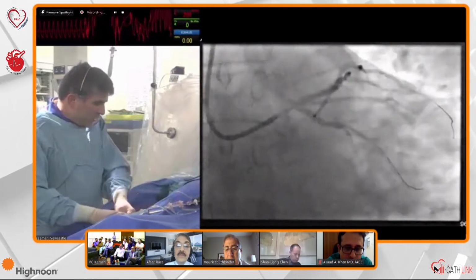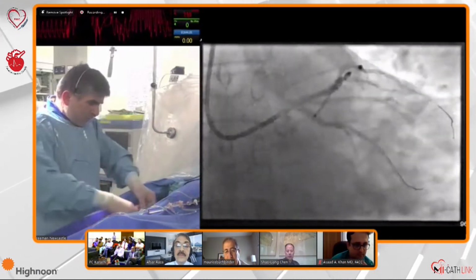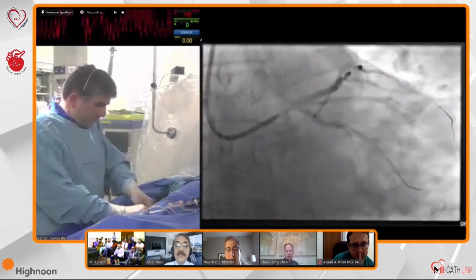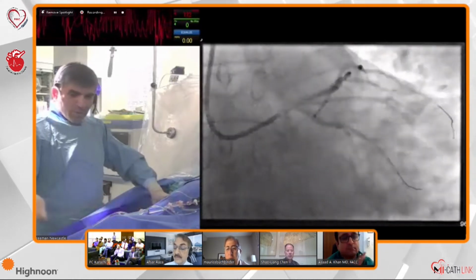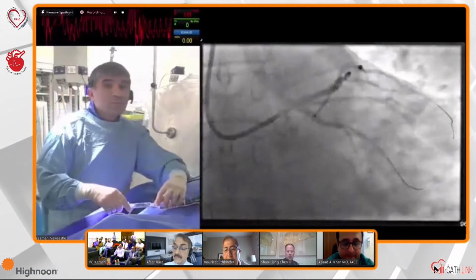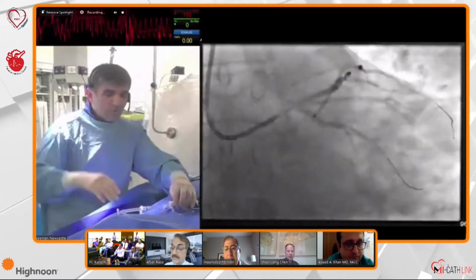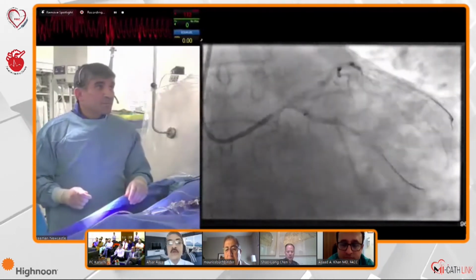Can you give me an angiosculpt 3.5 by 15 or 20 angiosculpt, please, if we have it here. If you have 20, I use angiosculpt frequently. That's fine, 3.5 by 10. Let's not waste time. It's a 3.5 for the circumflex.